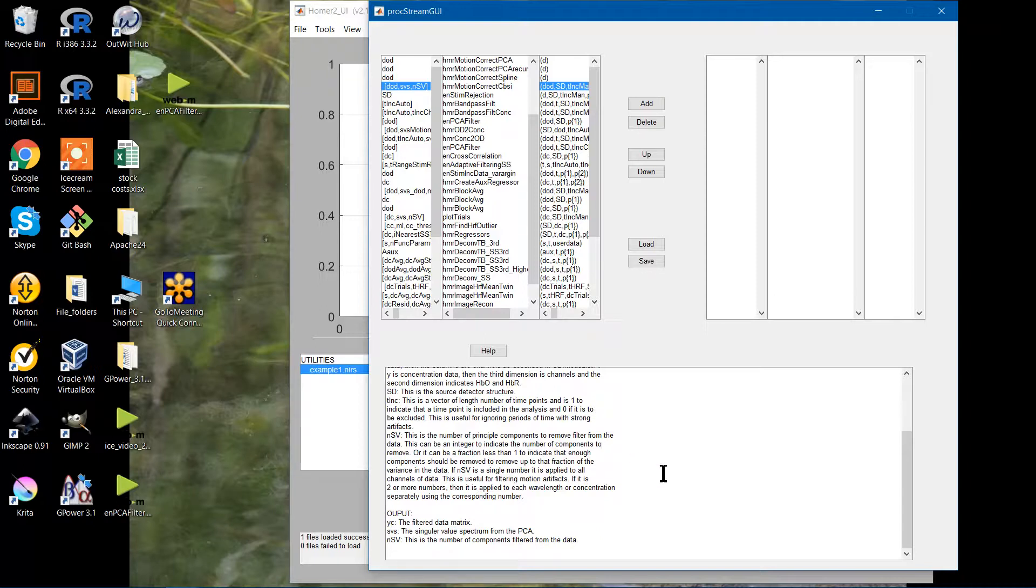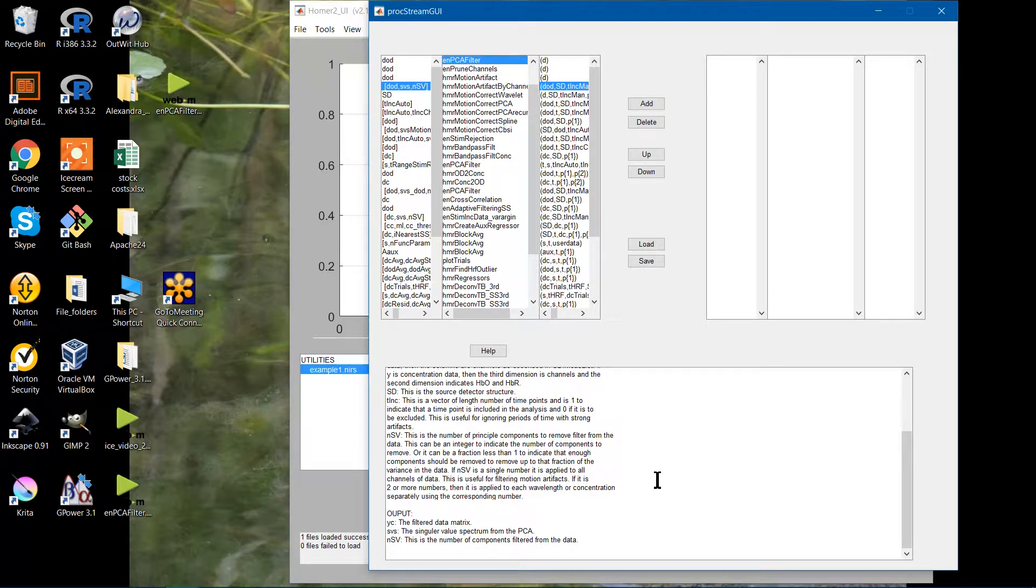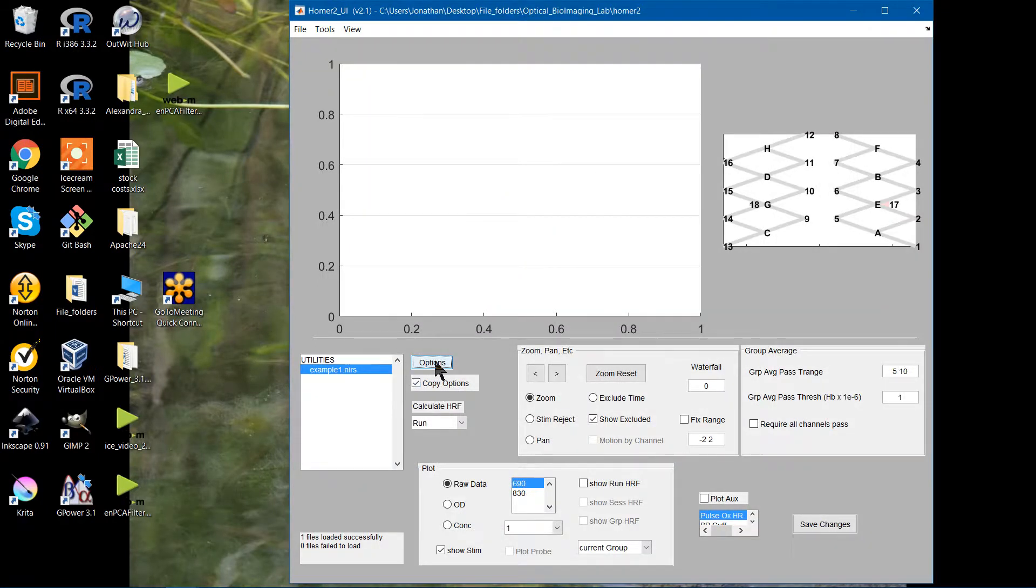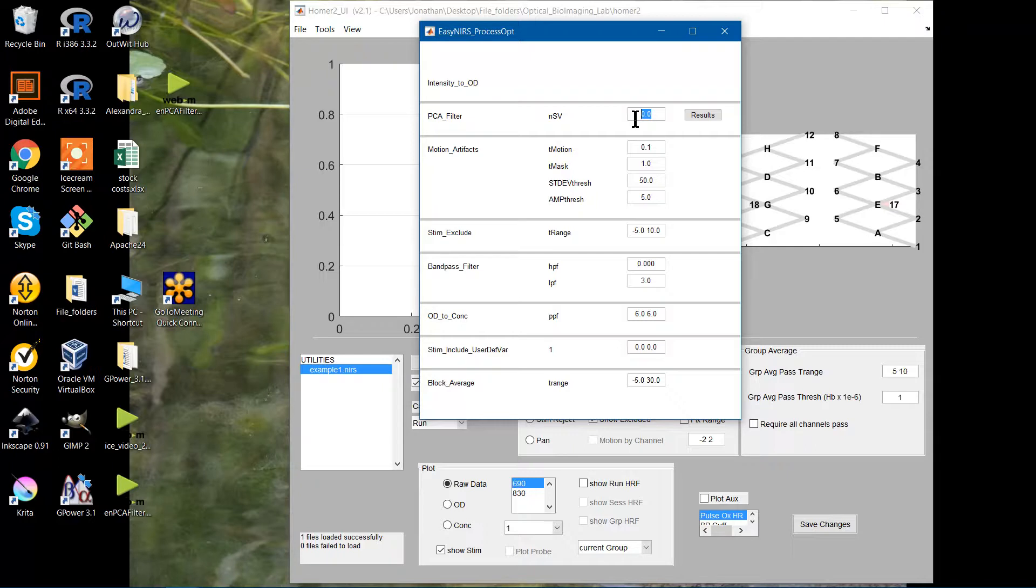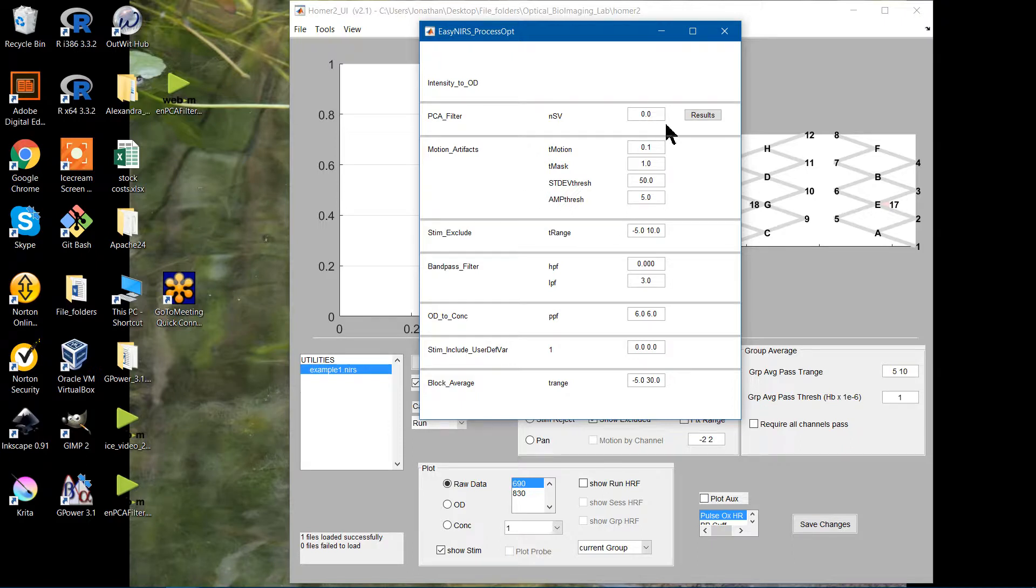So if you actually go back to where you input your numbers, you have these options. You have three different ways to implement this. You can use one integer as your input, you can use two integers, or you can use a decimal, which will behave somewhat like a percentage.